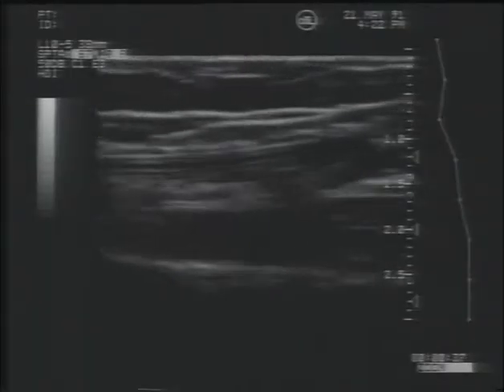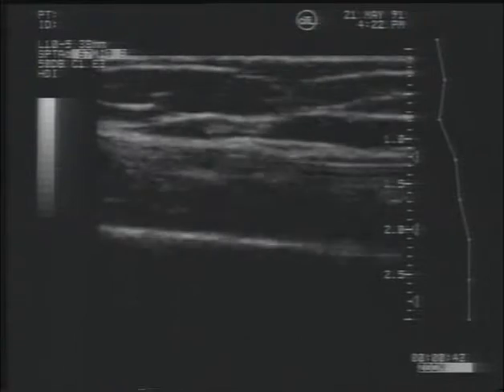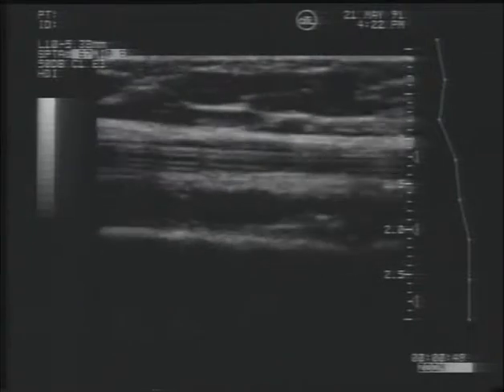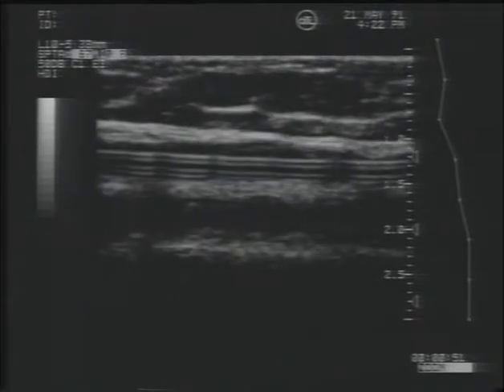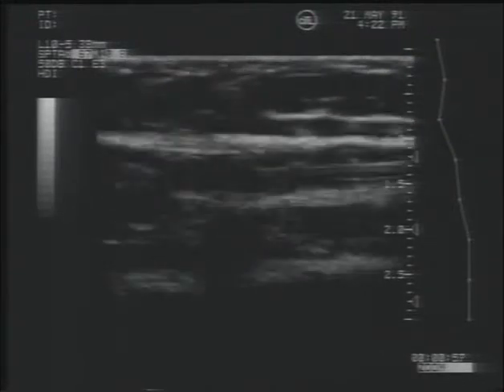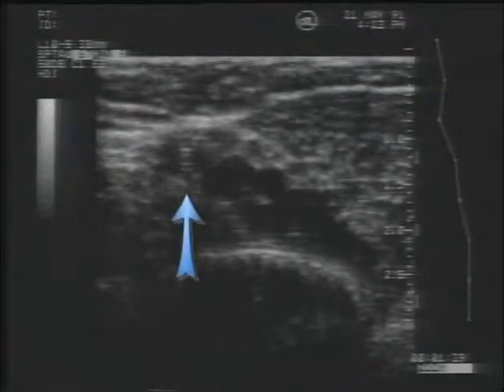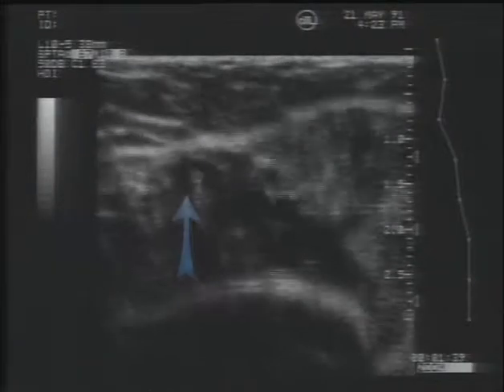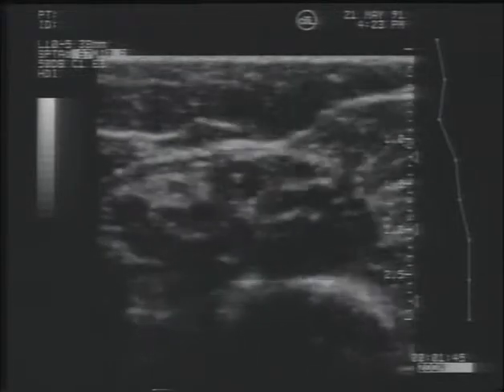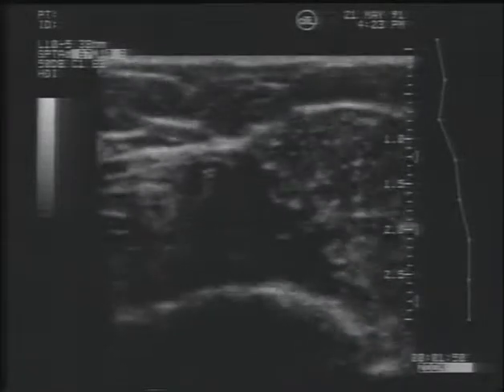Once you know you are visualizing the vein, you can usually assume any solid echogenic material within the vessel that restricts compression will be thrombus. There are some exceptions, however. The most common non-thrombotic structure that will be encountered during venous imaging is the venous catheter. These catheters are quite common, especially in intensive care unit patients. When encountered during transverse venous imaging examination, the catheter may at first appear to be a small, non-obstructive area of thrombus within the lumen of the vein. It will appear to be very brightly reflective.